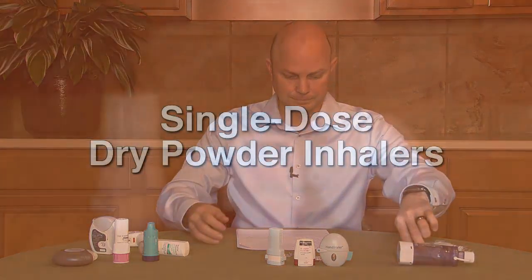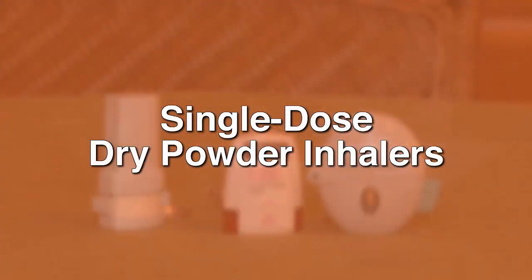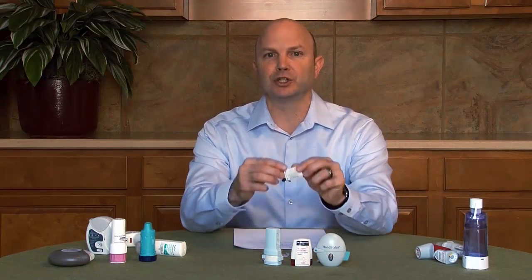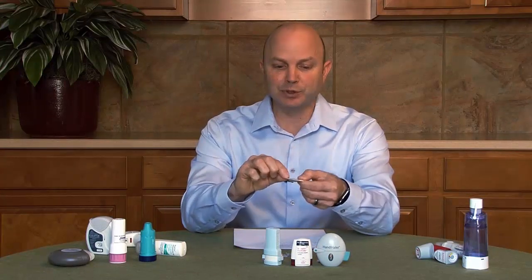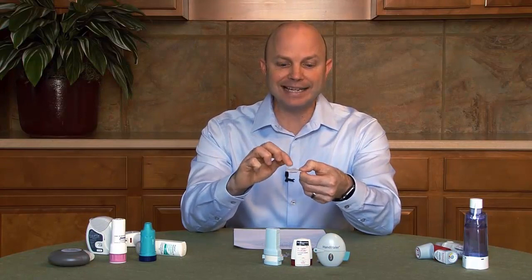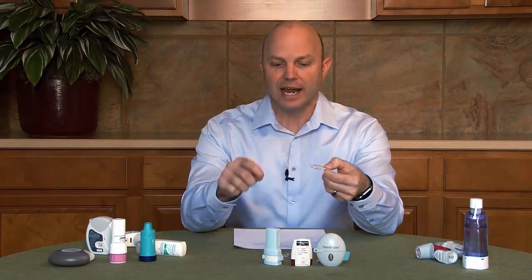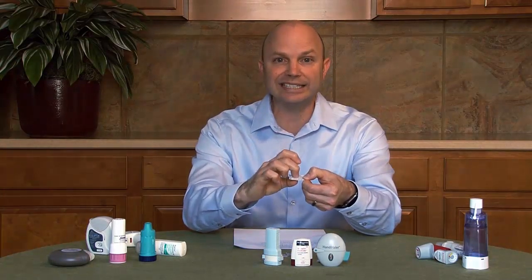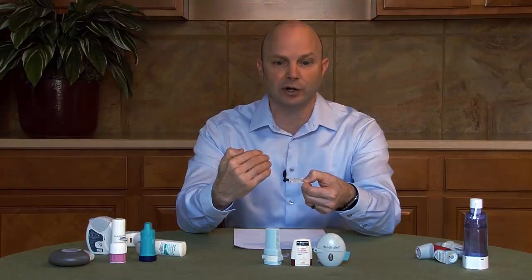Now we're going to talk about single dose dry powdered inhalers. This is a dry powder inhaler that you're going to take a fast, deep breath and inhale into your lungs. These come with a blister pack. Each of these capsules inside, this is not a pill, you do not swallow it. The medicine inside is very small, and when it's inside of the device, you'll have a piercing device. You'll need to pierce the capsule in order to release the medication that can be inhaled into your lungs.